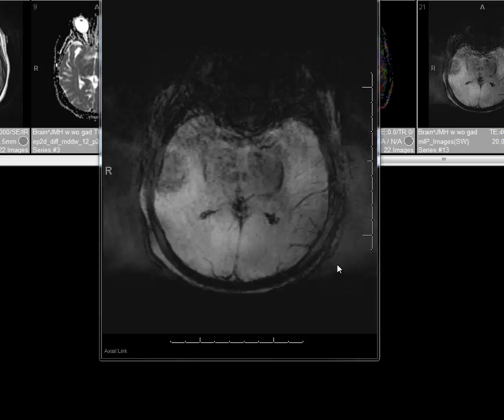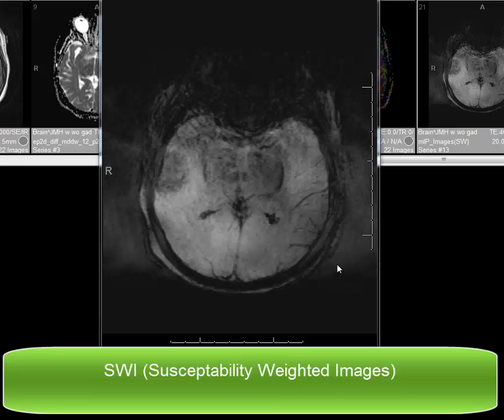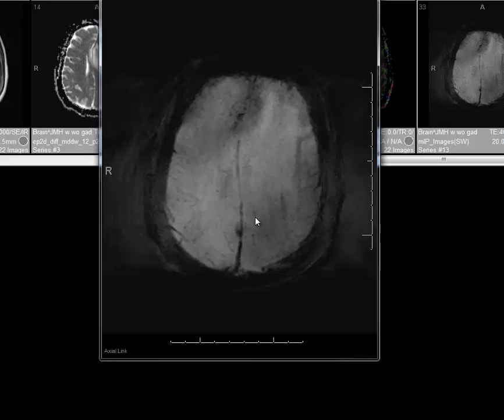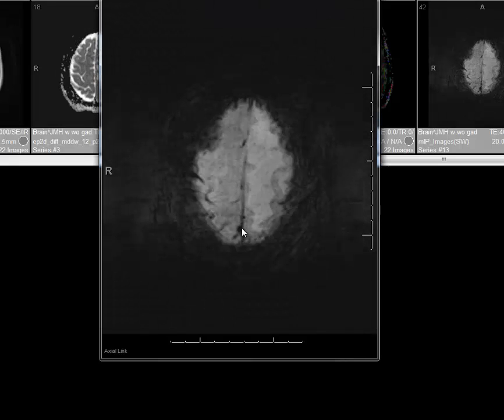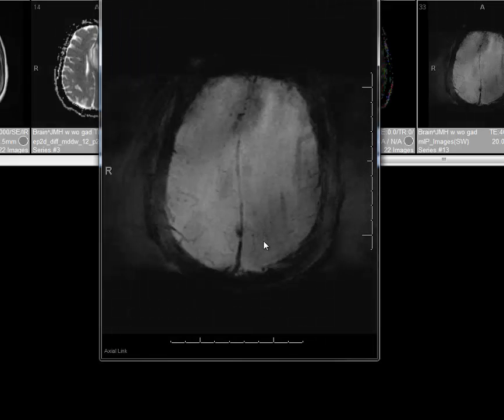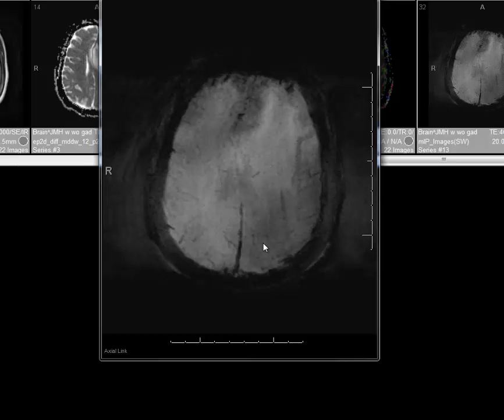Therefore, the gradient echo sequence is used in cases of trauma or studies searching for blood products or calcification. However, what I am showing here is the SWI sequence — the susceptibility-weighted image — which is even more sensitive to paramagnetic substances such as blood products and calcifications. Here we see calcifications in the choroid plexus and calcification in the dural surfaces, a dural plaque. This sequence is very good for blood products and calcifications and has mostly replaced the gradient echo sequences in our institution.